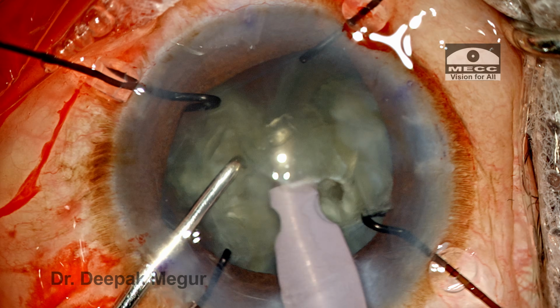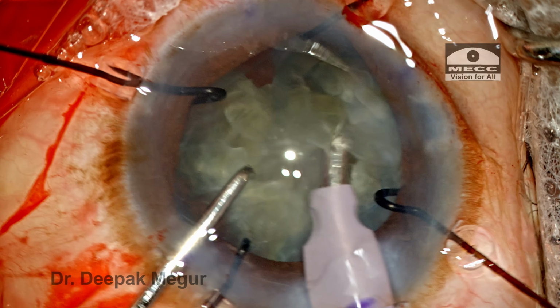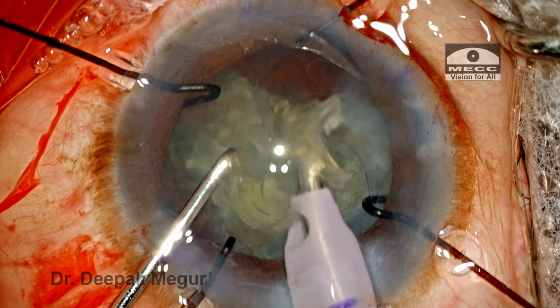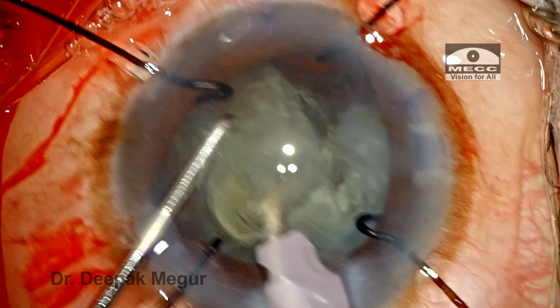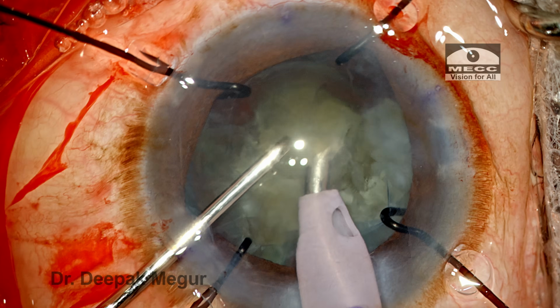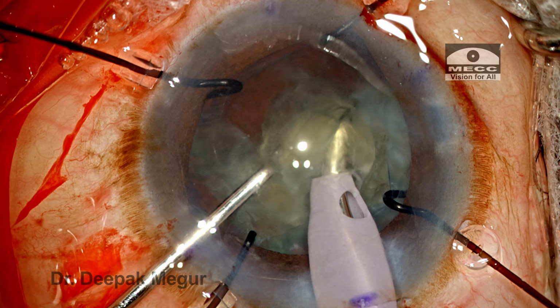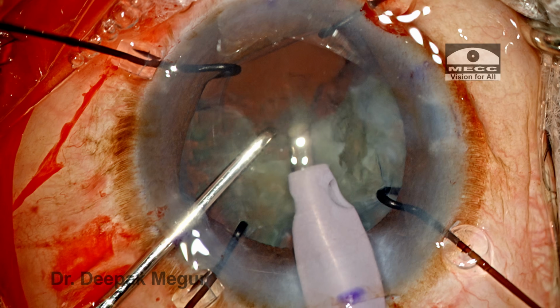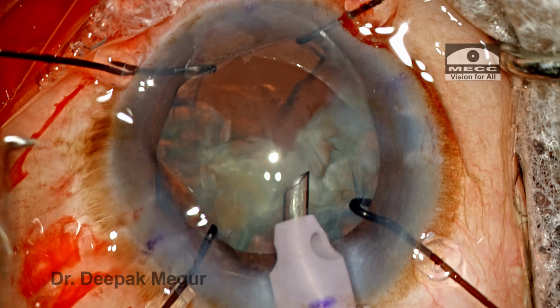I'm going in and removing these small fragments out of the bag and then emulsifying them one by one at the rhexis plane. Because the emulsification is being done a little bit more anteriorly, I need to refill the chamber with OVD so that the endothelium stays protected.